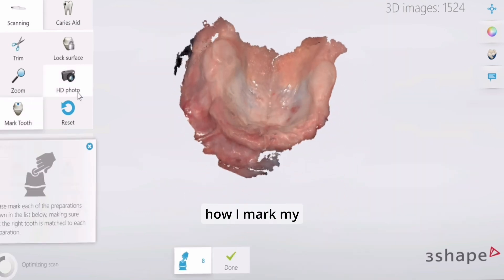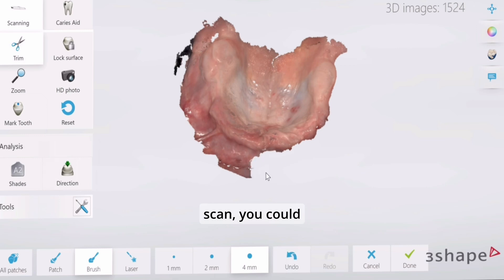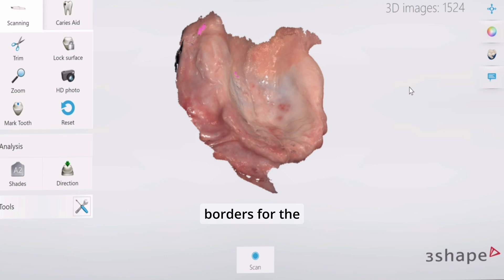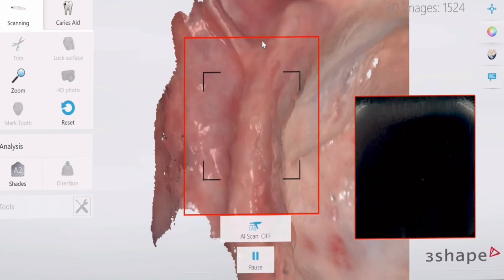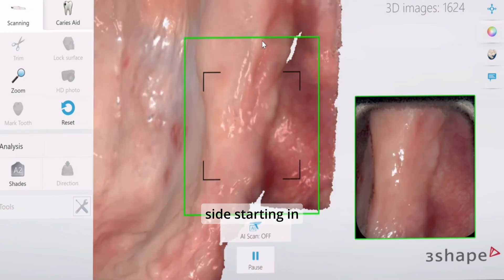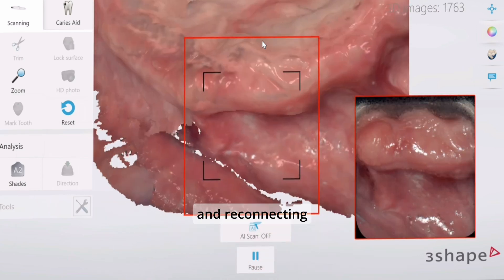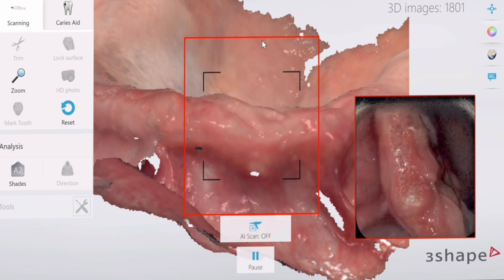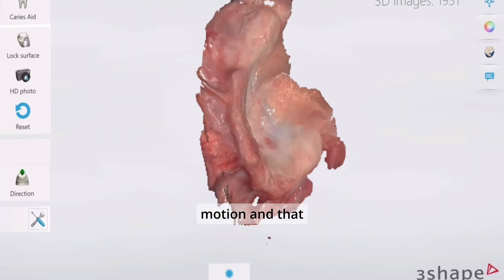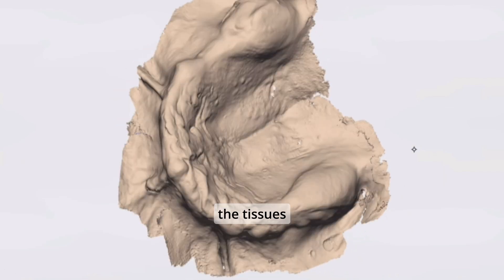I like to go from hamular notch to midline and then contralateral hamular notch to midline — that's going to ensure that we have the tissues in one position. If you want to know how I mark my denture borders from an intraoral scan, you can watch my top tip on denture borders for the maxillary arch. Once we capture one side of the arch, we get the contralateral side starting in the hamular notch and reconnecting to that midline position, making sure to do it in one continuous motion without moving the tissues all around.